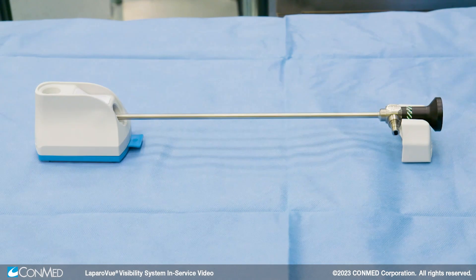LaproView is designed to be kept on the back table, but if the unit is brought to the scope instead, keep it no more than 45 degrees from the upright position to prevent surfactant from escaping the cup.